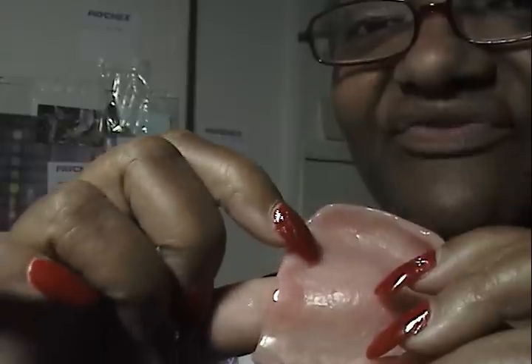And then what I'm going to do tomorrow after I power up my Dremel again is I'm going to take this whole little section out right here. It's going to be a nice fat U. Because on my partials, I don't have it. I know partials are different, the weights and balance, the front and back and all that good stuff.